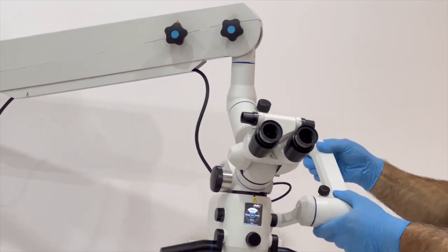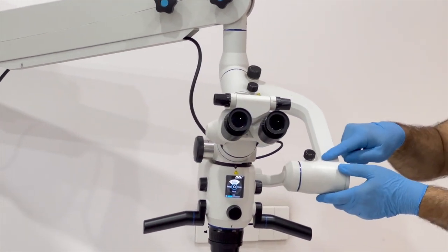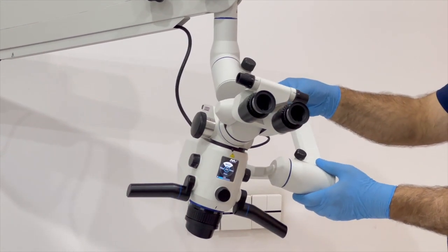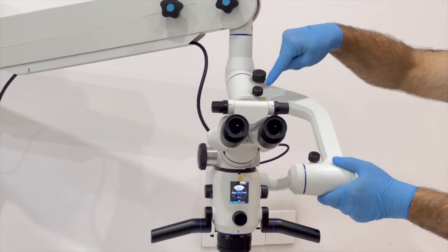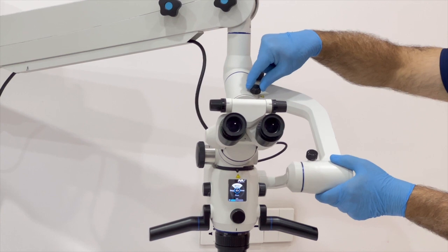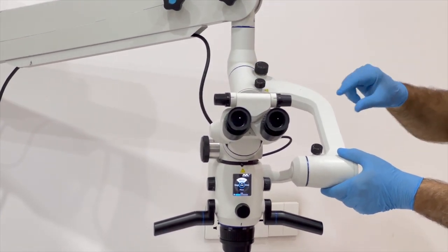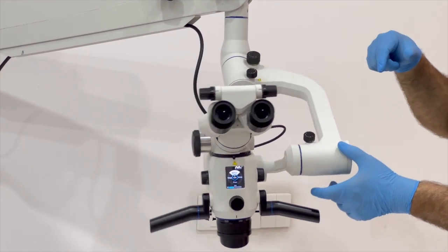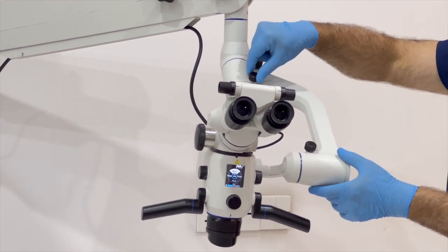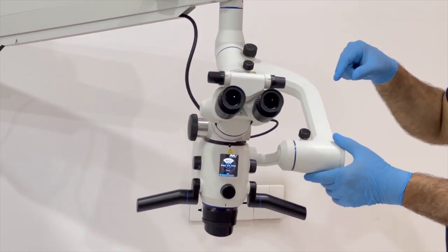Then we are going to talk about the movement of the head of the microscope. So we have a lateral movement or rotation. This screw is responsible for the tightening and loosening of this arm. Now I lock it, so it is locked. Or I can loosen it, so it becomes very loose. So you can tighten a little bit to make it as you want it to be.